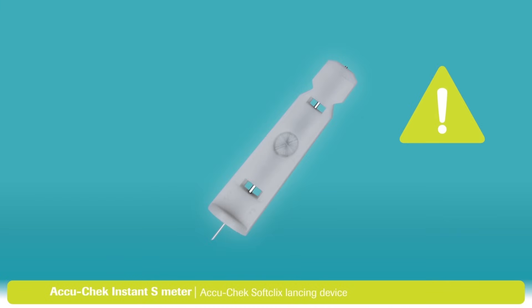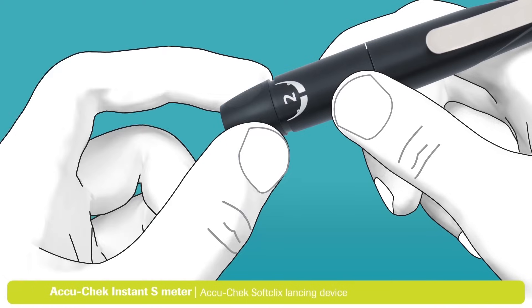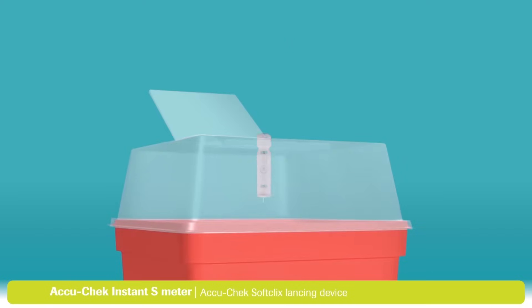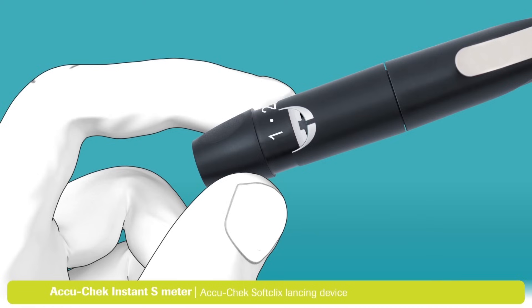This part is important: the AccuCheck SoftClicks lancets are disposable and should only be used one time. A reused lancet is no longer sterile, will lose its sharpness, and will become more painful each time you lance your finger. When disposing of a lancet, always make sure it cannot cause injury and always use a sharps container. To dispose of the lancet, remove the cap from the lancing device, point it into the sharps container, and eject the lancet by sliding the ejector forward as shown. Then put the cap back on the lancing device.